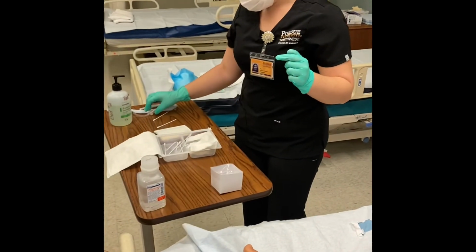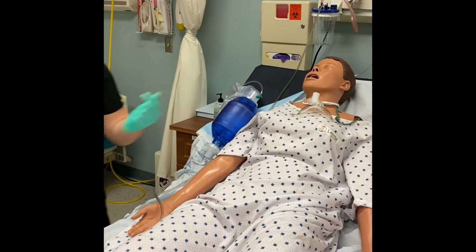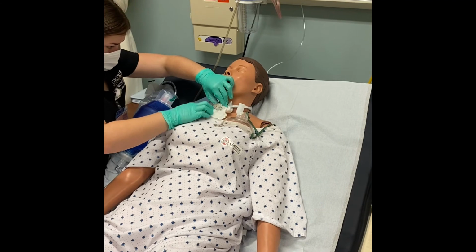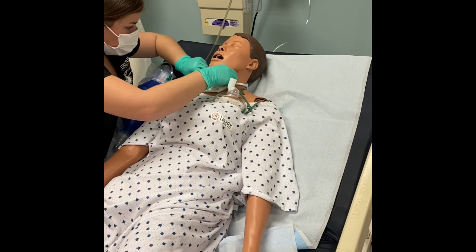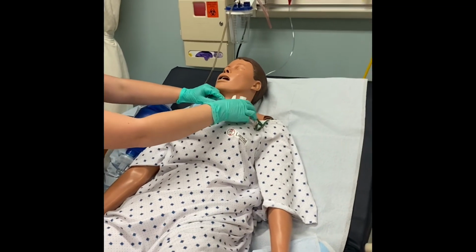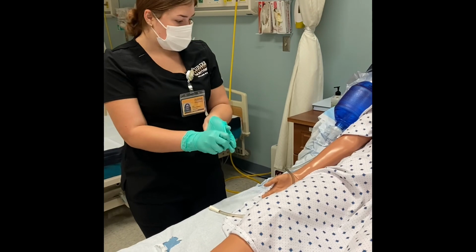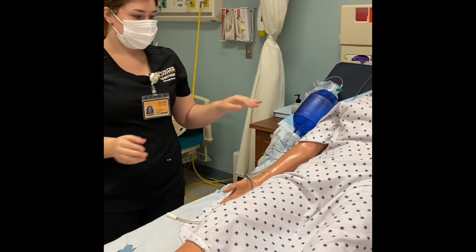Okay. Then at this time, since the cannula was interchangeable, I would hold the plate in place and insert the new one. And then I would also put the new dressing on while holding the plate in place. And then I would reapply the oxygen on my patient. And then at this time, I would grab an assistant to help me interchange the neck band on my patient. And once that's completed, I would take my sterile gloves off, discard all my supplies, and perform hand hygiene. I would place my patient back into a comfortable position, and that's it.